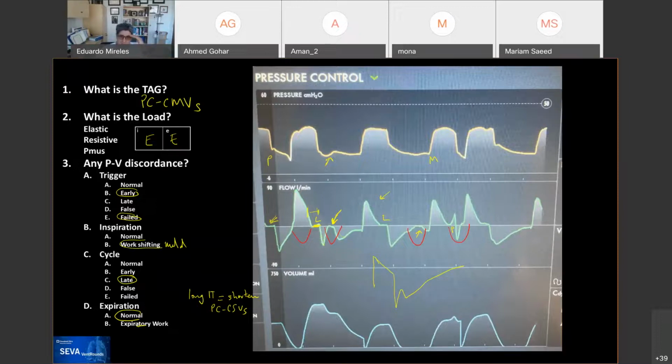And the answer, and I'll show you the reaction to pressure support, but the patient would hypoventilate, or it would go really fast on its rate, which seemed to be due to a problem that you'll see in a second. Can I add a quick comment or question? Yes. Kind of on the same point that Mariam is wondering about.